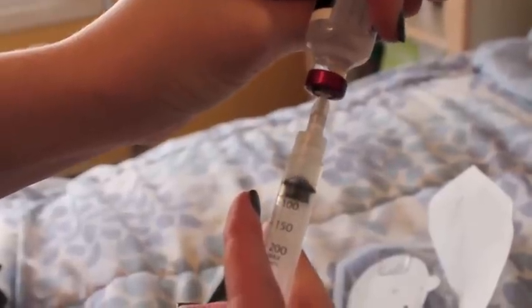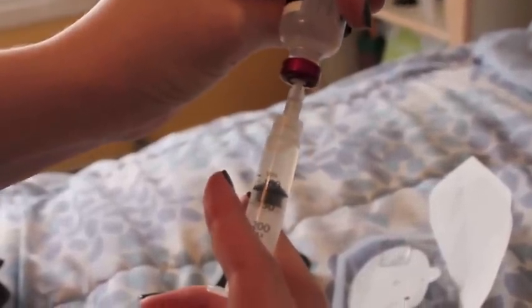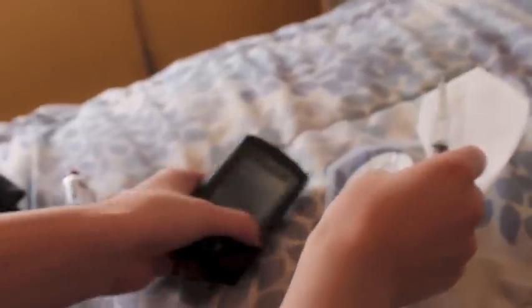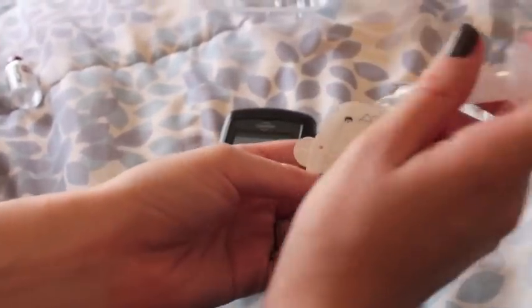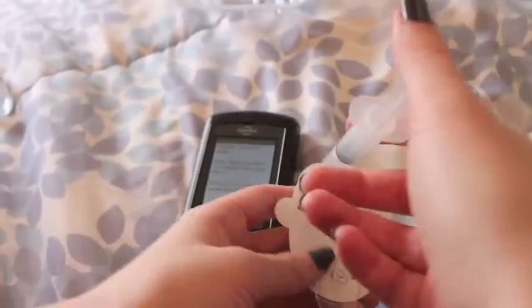Something that's great about the Omnipod is that even though you'll get a lot of bubbles in your syringe, you don't have to worry about it too much, because once you do the next step, which I'm about to show you, it will prime the bubbles out for you. So it's still on this screen that says to fill it with insulin and wait for the 2 beeps, so we're going to do that now. With the new generation of Omnipods, they like it for you to have the Omnipod right next to the PDM.